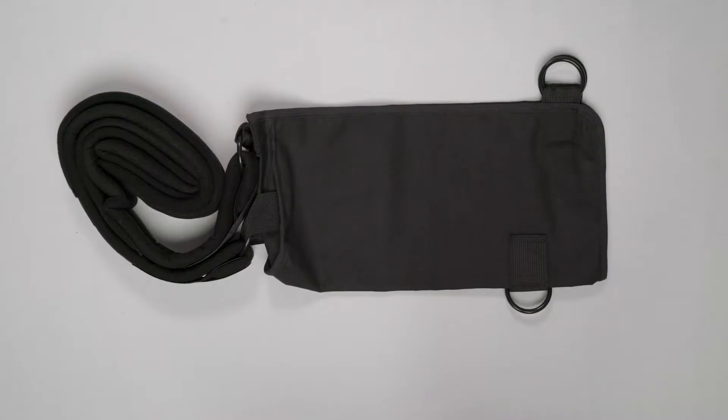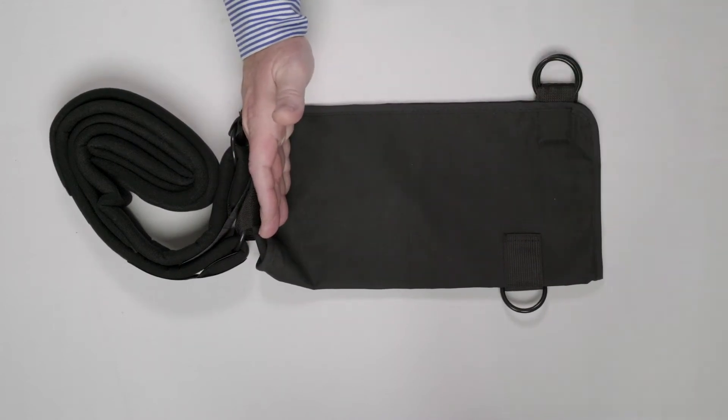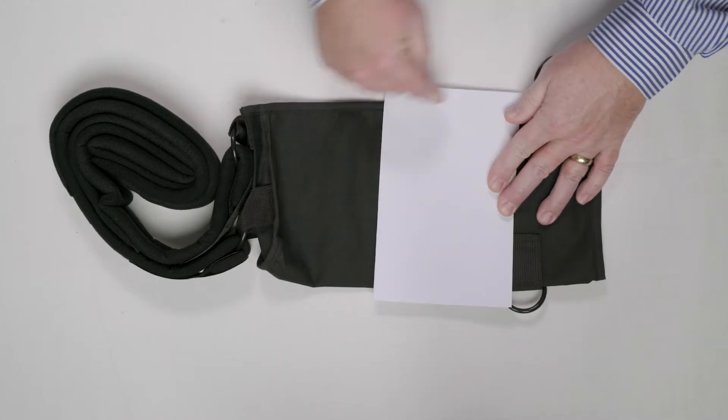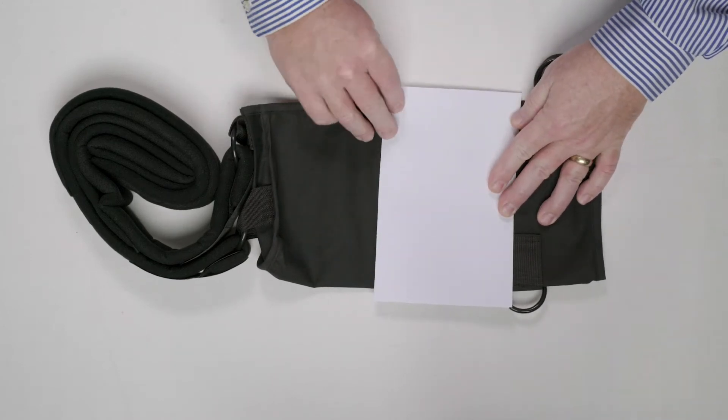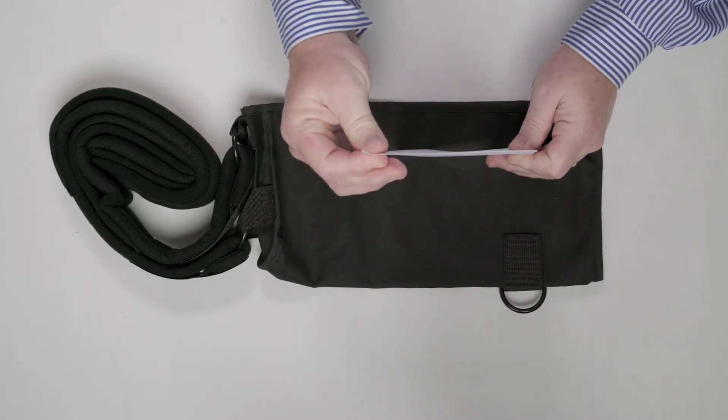First off, the body of the sling is called an envelope because most slings are made like an envelope. The material is simply folded over, a single stitch is put here along the back, straps are attached, and they are sold to you. But the question I have is: who is shaped like this?